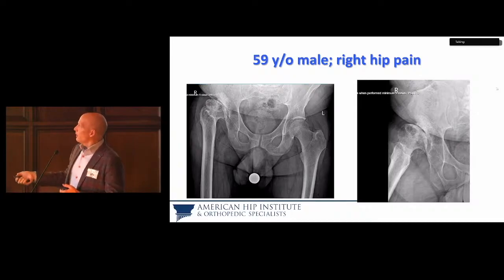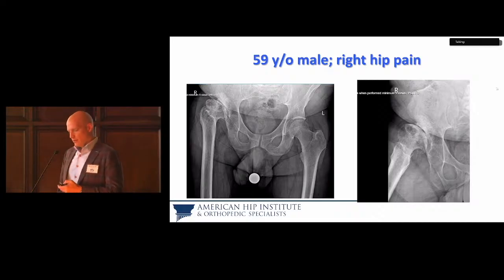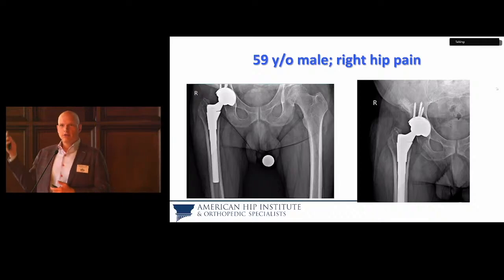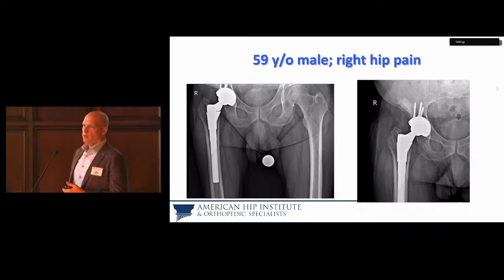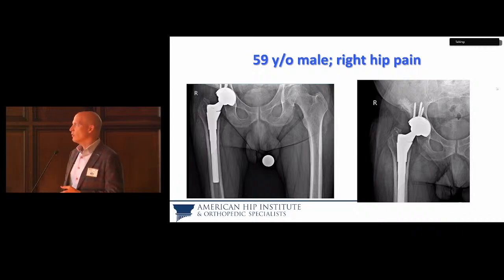Again, very, very shallow acetabulum. Am I going to be able to bring and put that acetabulum back down where it needs to be? And just careful planning, having a lot of different implants available in the OR depending upon what you need. But again, I was able to bring the acetabulum down. I think we talked before about dual mobility. This is modular dual mobility, so I do use dual mobility in my higher, more complex patients if I have any concern for instability. Again, SROM, I didn't have to do a shortening in him, but still had the SROM available, so went ahead and used it.